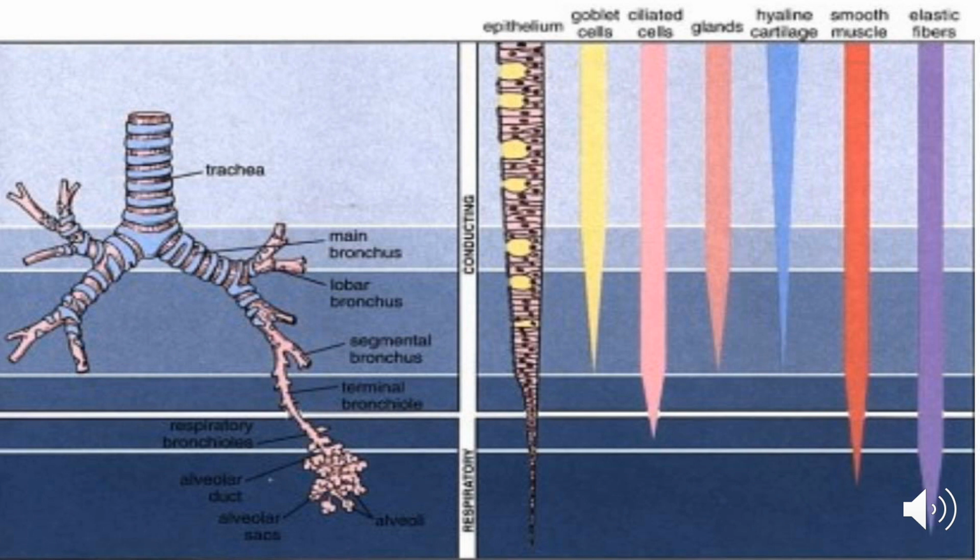Expect that at the level of the alveoli, the epithelium there should be simple squamous, because if you place pseudostratified ciliated columnar, the height of these cells will cause obstruction in the alveoli. So what is our conclusion in terms of the epithelium? The epithelial cells of the trachea are taller than those of the bronchi. The epithelial cells of the bronchi are taller than those of the bronchioles, and so on and so forth.